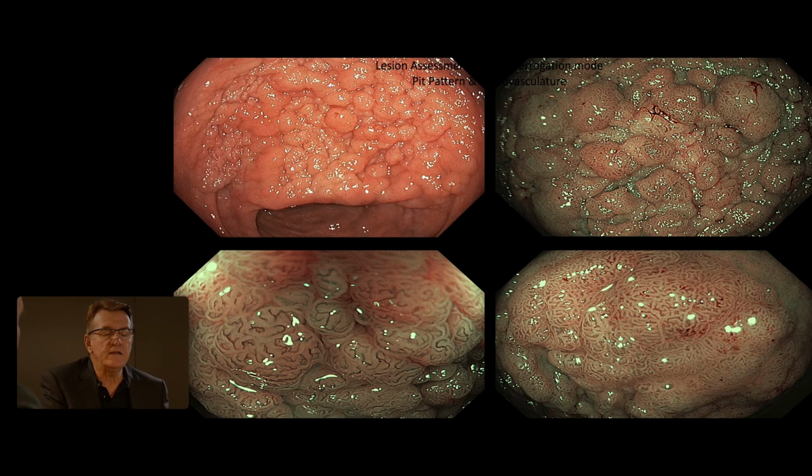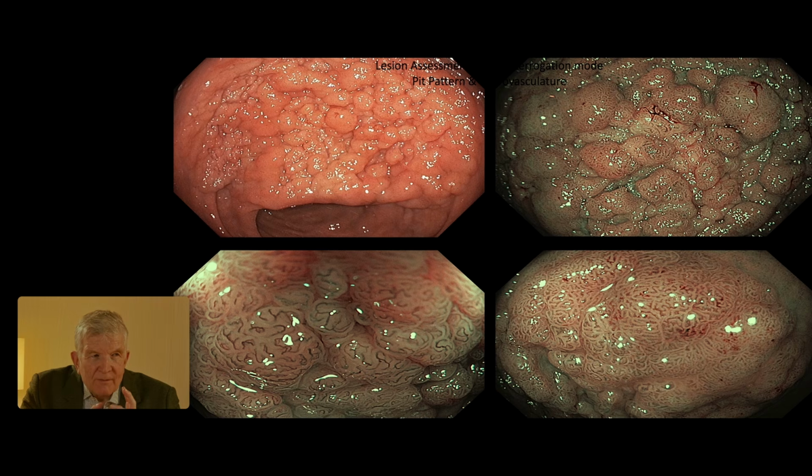And then if we're in doubt about the morphology of that nodule, we compare it with the surrounding mucosa, a real-time comparison. You can also do this when you're looking at an adenoma and ask, is that adenoma or not? Well, that's normal mucosa. It reminds you, this is small regular pits, and these are branching longer pits. So it's not that you're looking for the 500 micrometer spot, which might be a little bit irregular, because then you get crazy.